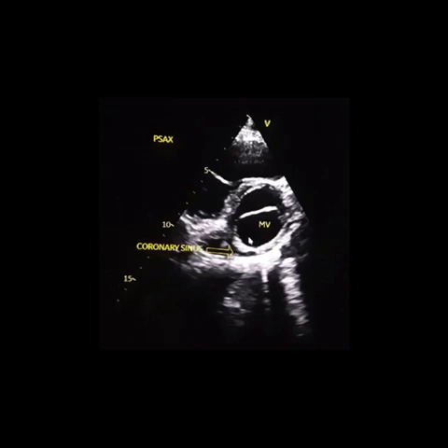So this sinus has the importance of CRT, that is synchronizing pacemakers, in which one lead is inserted in this coronary sinus and pacing can be done here. So there lies the importance of seeing the coronary sinus in a short axis view.